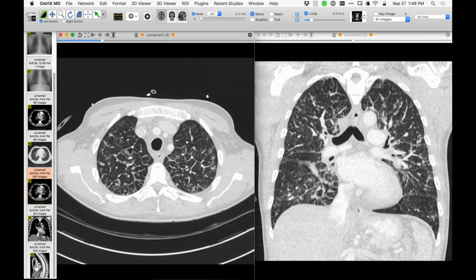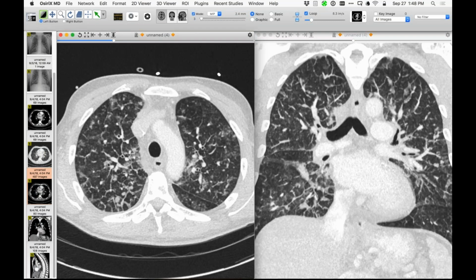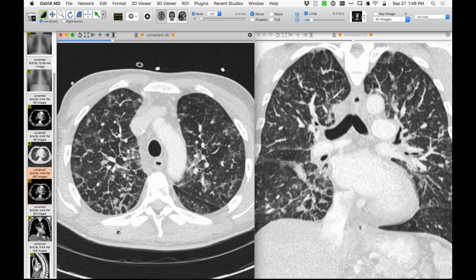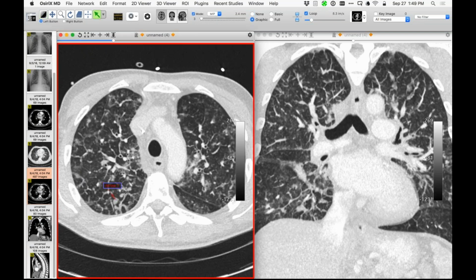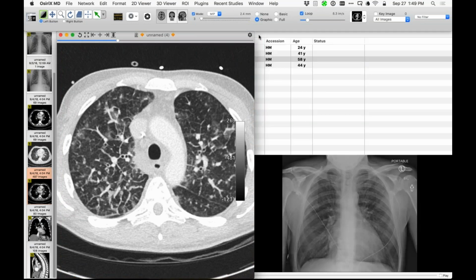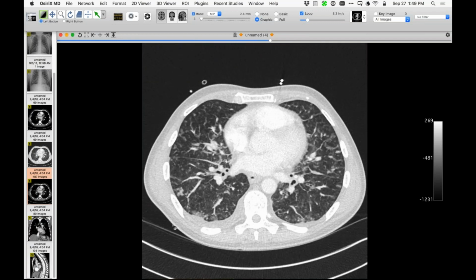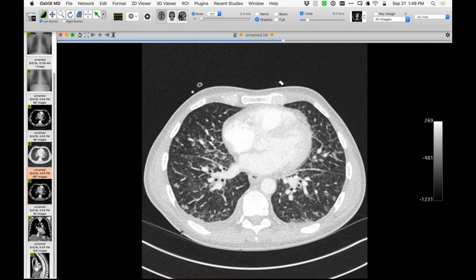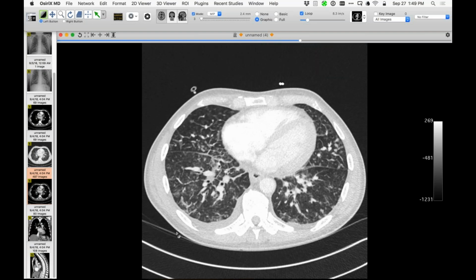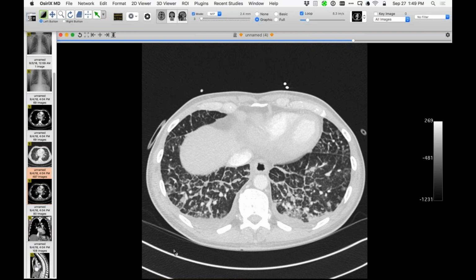So a really nice example of the septal lake. So this florid edema, and then in locations like this, the lakes, the nodules, the lakes here are really nice examples of it right here and right there, for example, are really rather conspicuous. Of course, there's also foci of alveolar edema, but again, I'll just scroll through this one, and you'll see tremendous thickening of interlobular septa with lots of nodules of septal edema, making nodules there. So I always tell people, you don't have to invoke a different diagnosis for the nodules. They are septal lakes of interstitial edema. So a very nice example of that.